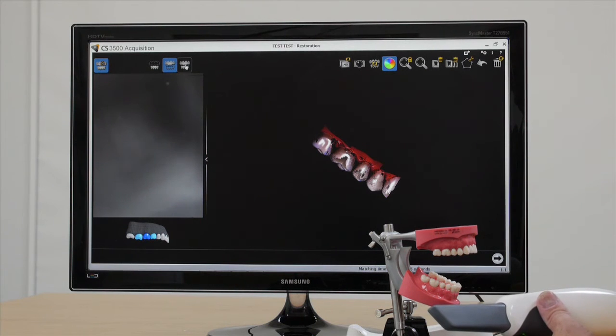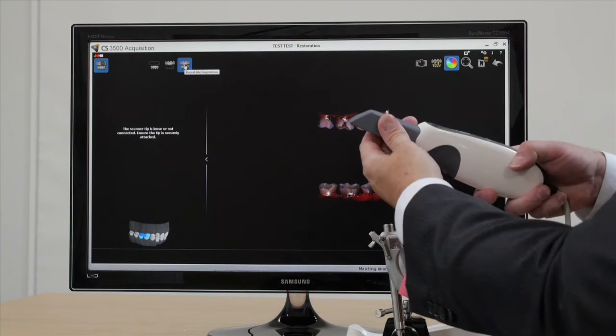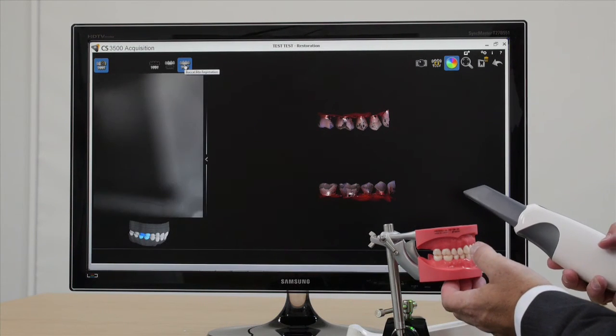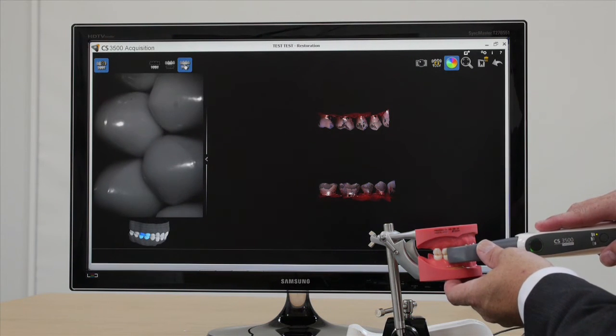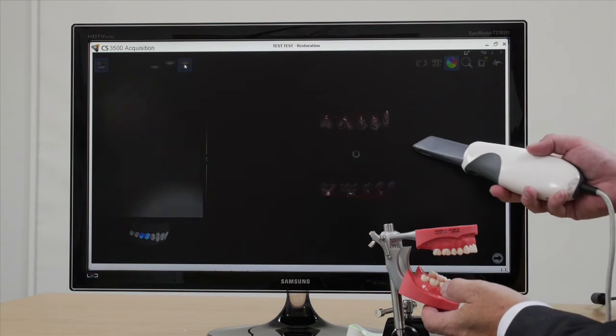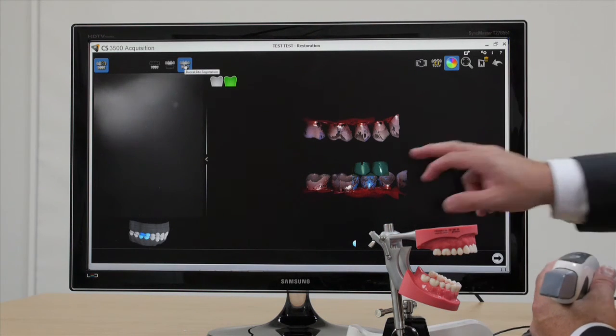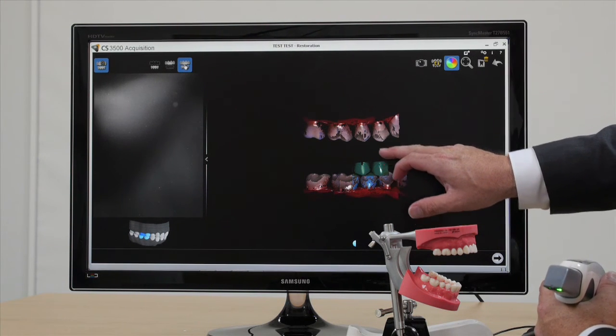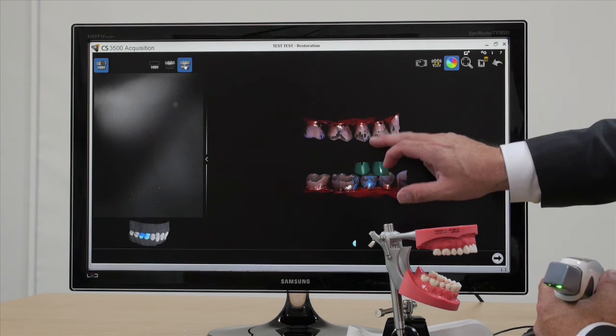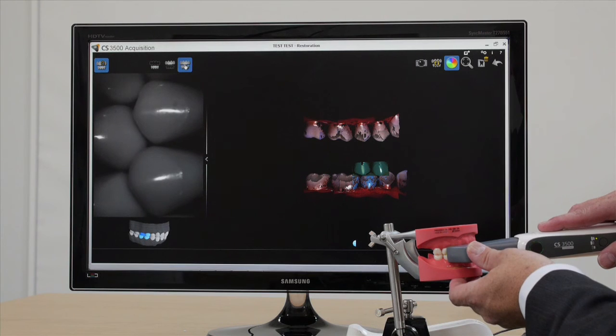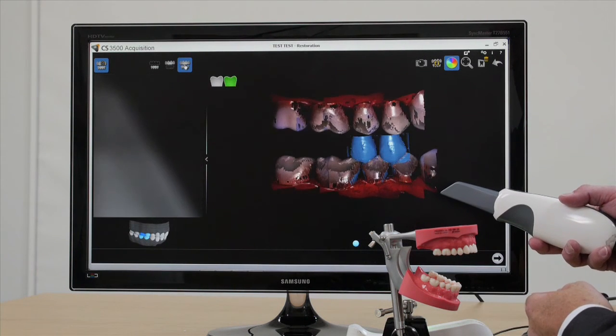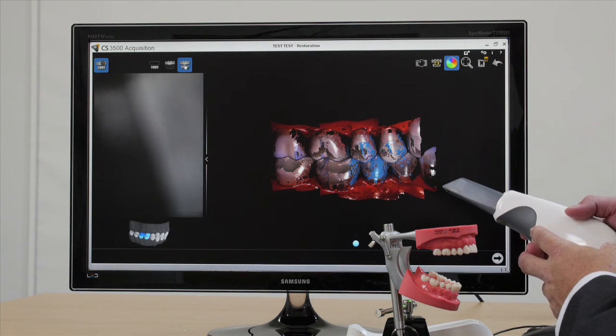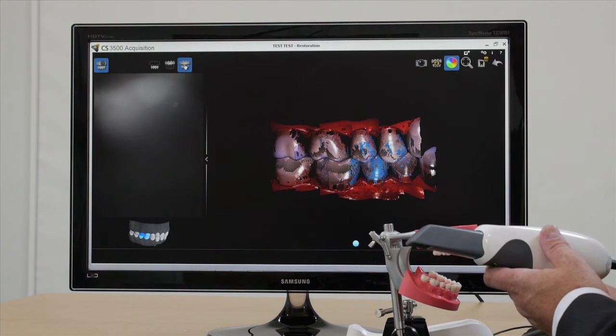Now we go for the occlusion. I've turned the tip around. Now the occlusion, get your patient to bite into centric occlusion. And what we're going to do is we're going to capture some pictures from the buccal corridor. And it's going to pull this into occlusion. So what it's told me here is it's located the lower. It wants another picture from me. And it's telling me where it wants the next picture. It wants the next picture in the premolar region of the upper, while your patient is still in centric occlusion. There we go. And there's your occlusion.